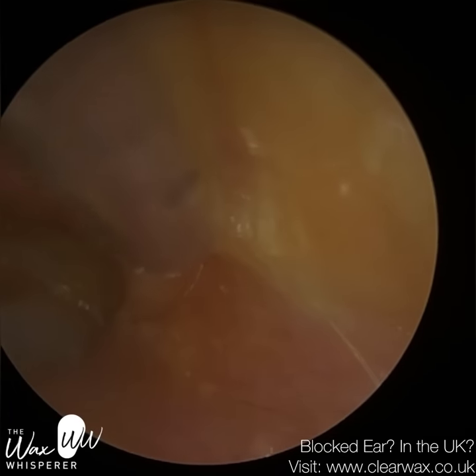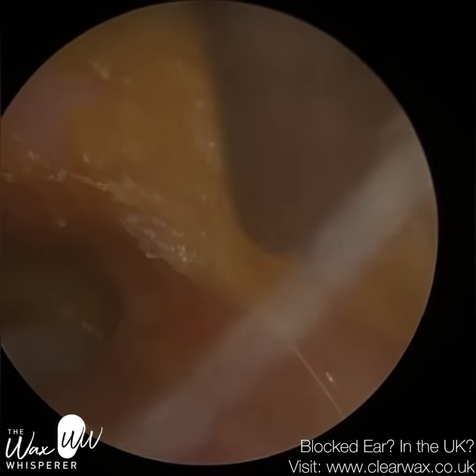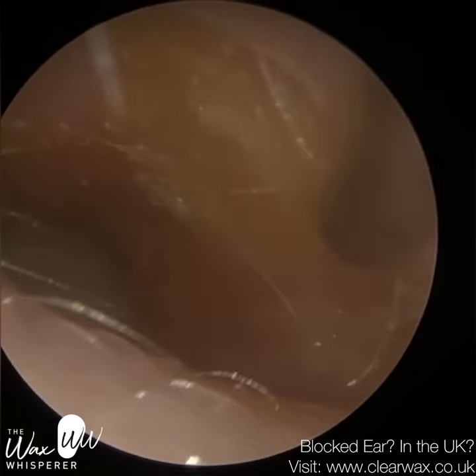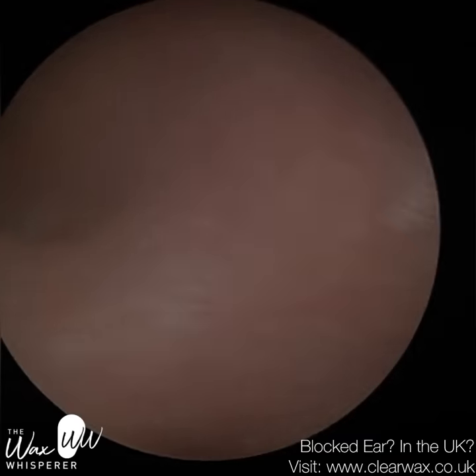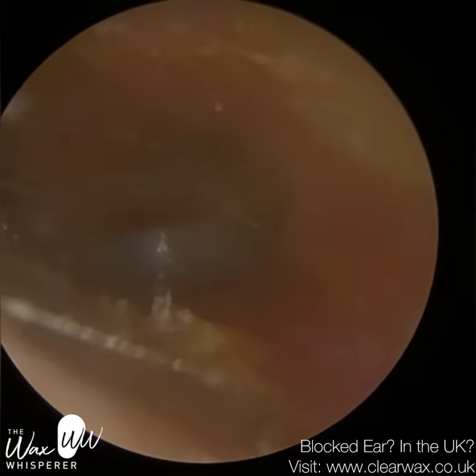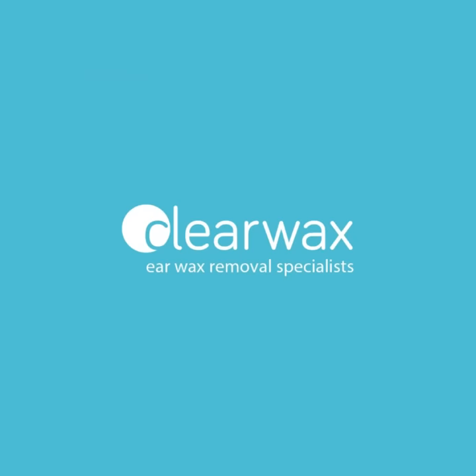Once all that's launched, I've got a couple of other new developments in the pipeline which I'm excited by — I can't really disclose much at the moment, but I'm working with a colleague on one of them. So that's the patient's eardrum — it's fully revealed now. You can see the hammer bone as well. There is a bit of debris around the edge, but that's all fine. Well, I hope you enjoyed that video, guys. Take care, keep well, and speak soon. Bye.